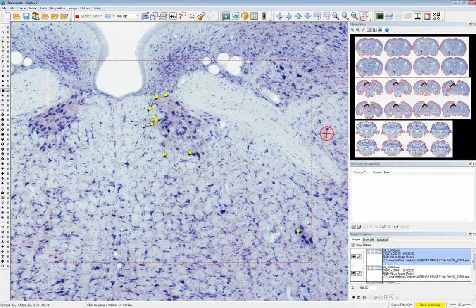So now that we have this data, as we said, we've got 3 individual slide images that each have 8 sections. And now you can see that we've got a contour and some cell markings for these sections on this particular image for this series of sections. But if we were to try to view these in 3D, it's not straightforward to do.